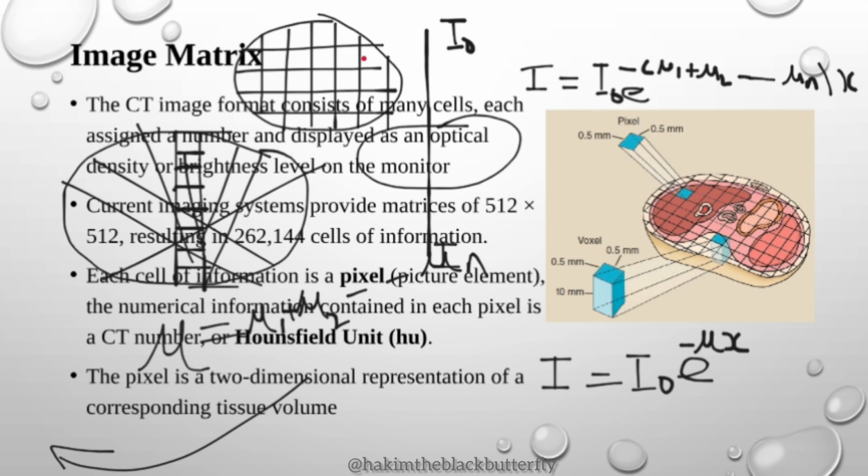Maybe if these pixels are, for example, pixels which are representing a liver, they can be of the same number because all of them are representing a liver. Of course, when they are calculated, the number carried by those pixels will almost be the same. But if other pixels are giving out information for the kidney, they are carrying a different number.